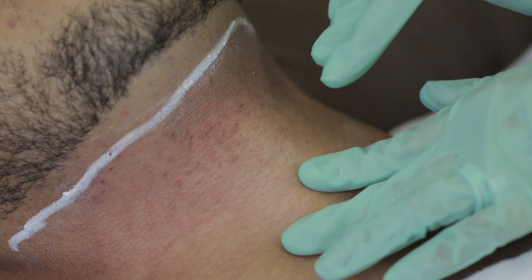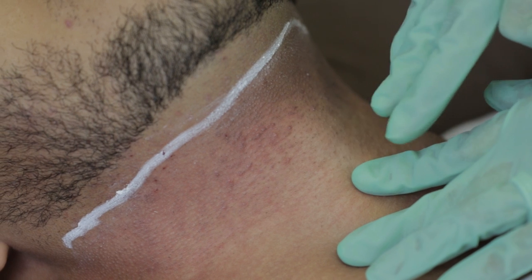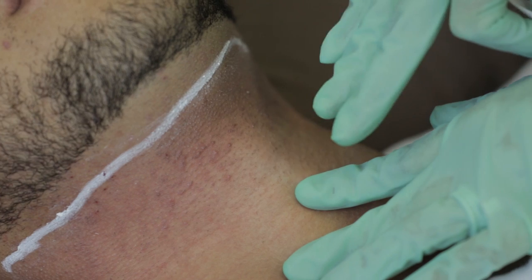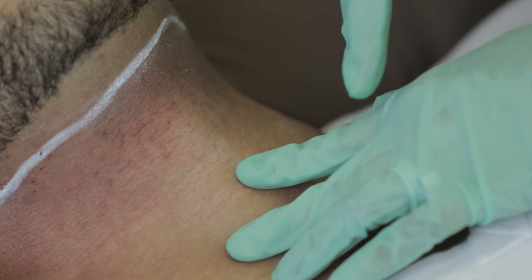Laser hair removal for Fitzpatrick types 4, 5, and 6 can actually be more painful than laser hair removal for Fitzpatrick types 1, 2, or 3, and that's just due to the amount of pigment that's in darker skin colors. That's very normal as well.